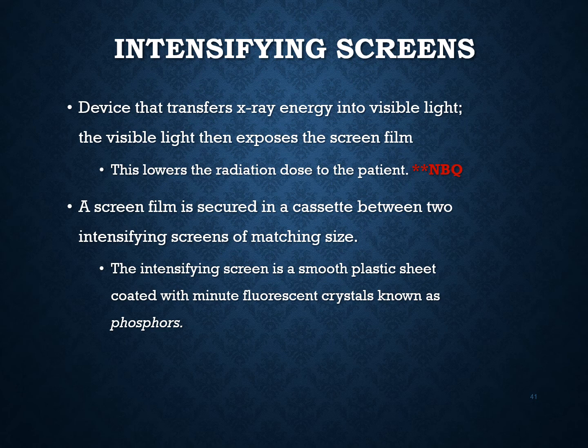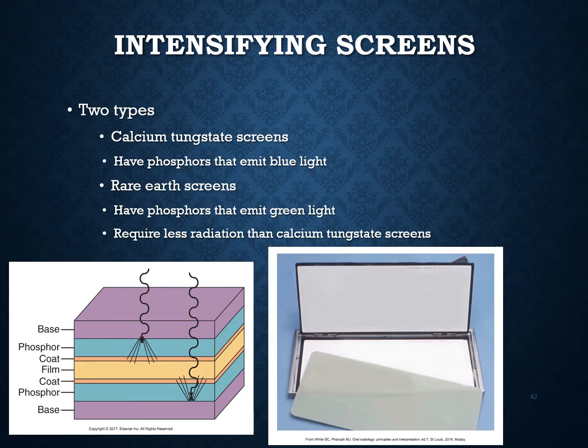This loss of detail makes panoramic X-rays unsuitable for caries diagnosis. For this reason, pediatric dentists take bite wings in conjunction with the panoramic X-ray in order to make a pediatric full set. All right, and here's what those intensifying screens look like.